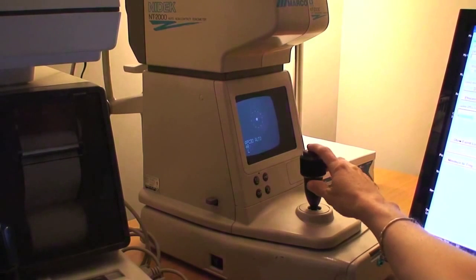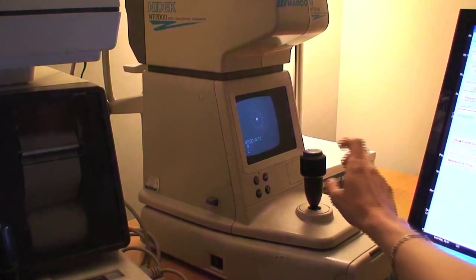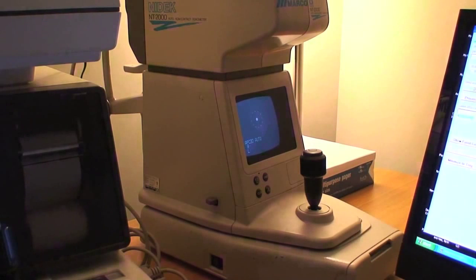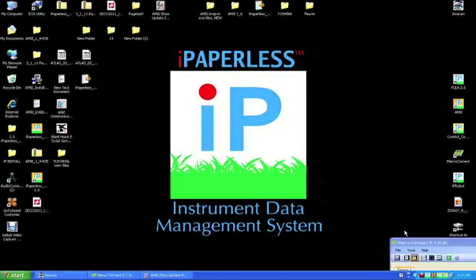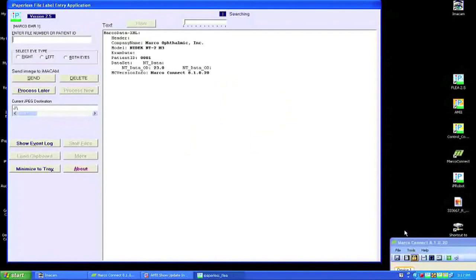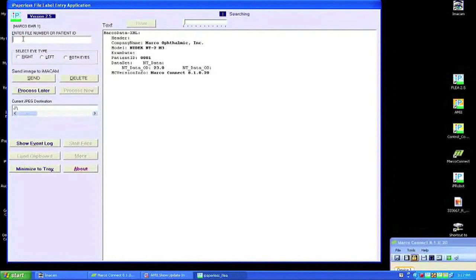We have written an iPaperless FLEA interface to route this data into iMacam for these instruments. You simply click Print. The data is then previewed in the FLEA where you add the patient ID, select eye type, and Send.